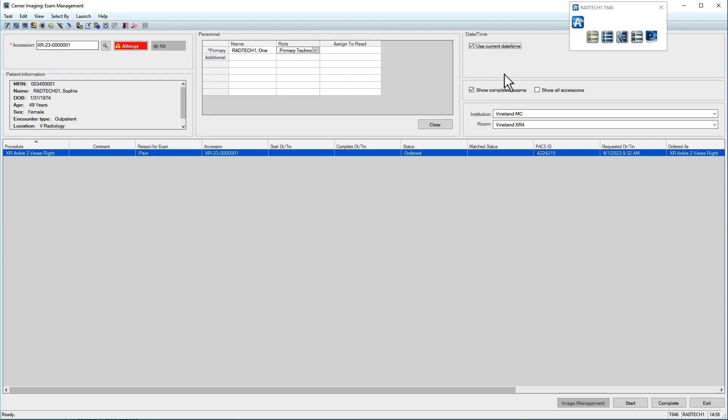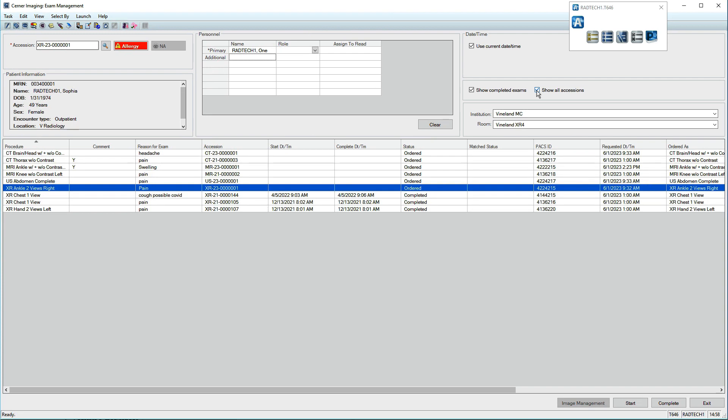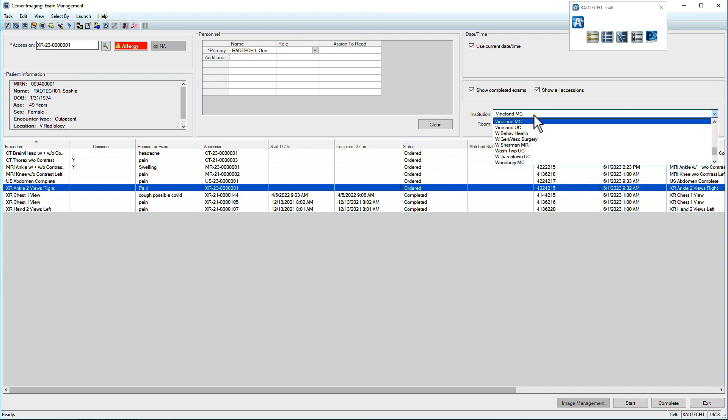Below, check the box to view all accessions. This aids your awareness of other exams to be completed and can help limit patient movement.